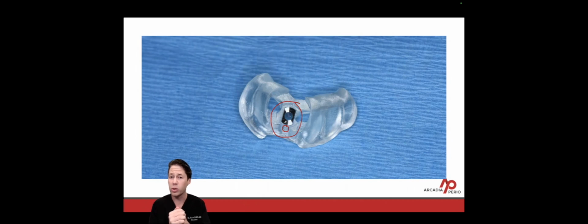So we've gotten the digital workflow down precisely. This works so well in my office using the SprintRay Pro 2 and their surgical resin. These 2 millimeter sleeves can be bought through Nobel Biocare, and they work wonderfully. I love these sleeves because they fit in more like a lock and a key. The sleeve doesn't move around at all because of the design. It has those two wings right here at the two different ends of the sleeve itself.